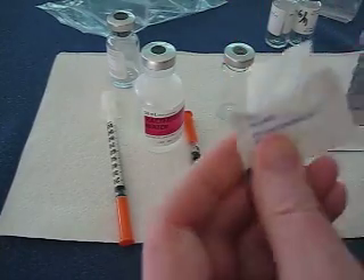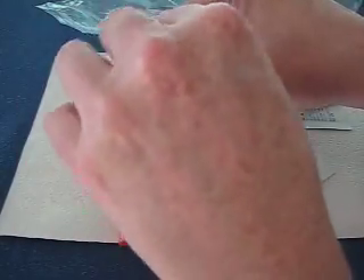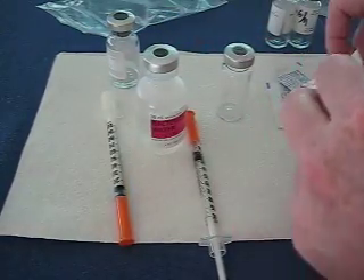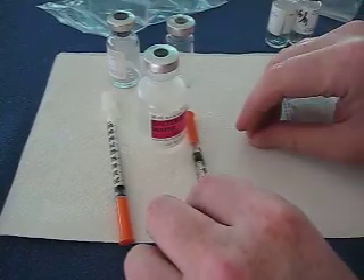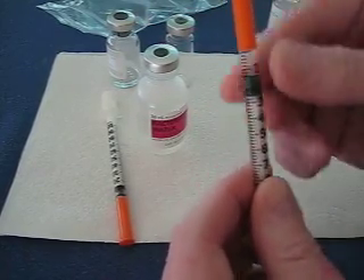You always need to make sure you're working in a sterile situation. So I have an alcohol swab here — I clean the top of the bottle, make sure I clean it well. I've already washed my hands to make sure they're clean, because you want to make sure that you stay clean and sterile. I filled the needle up to the 15 point with air.